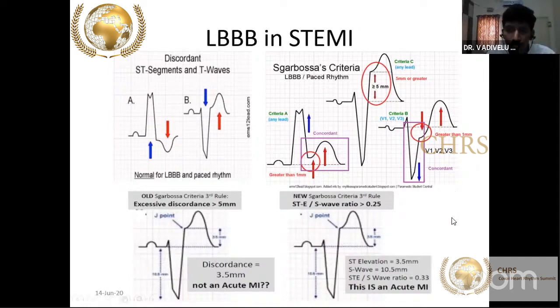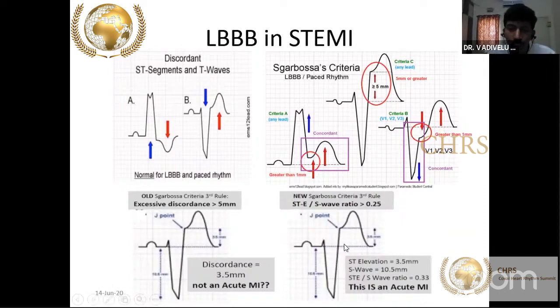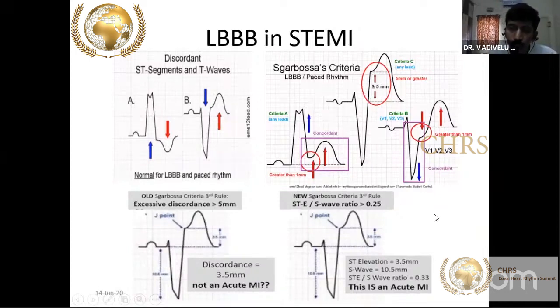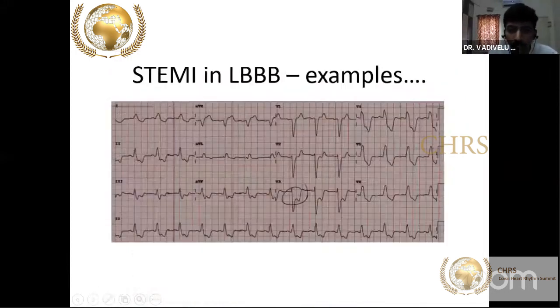Another important sign is the Cabrera notch — a notch in the ascending limb of the S wave, which is one of the soft signs for ischemia. Also, if the height of ST segment elevation divided by the height of the S wave is more than 25%, that is one of the criteria.